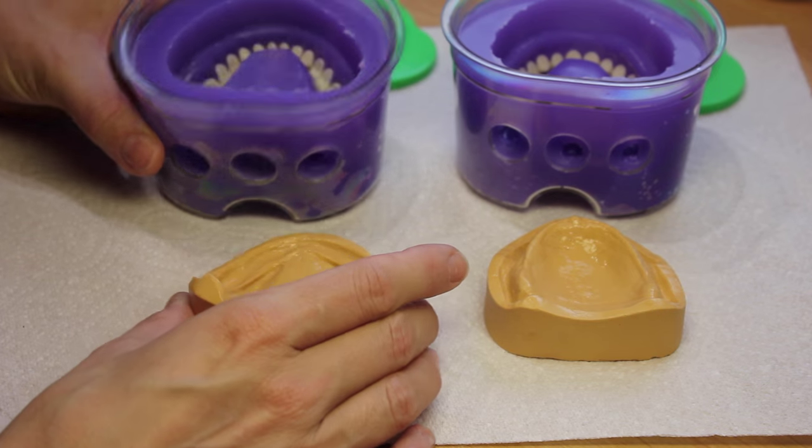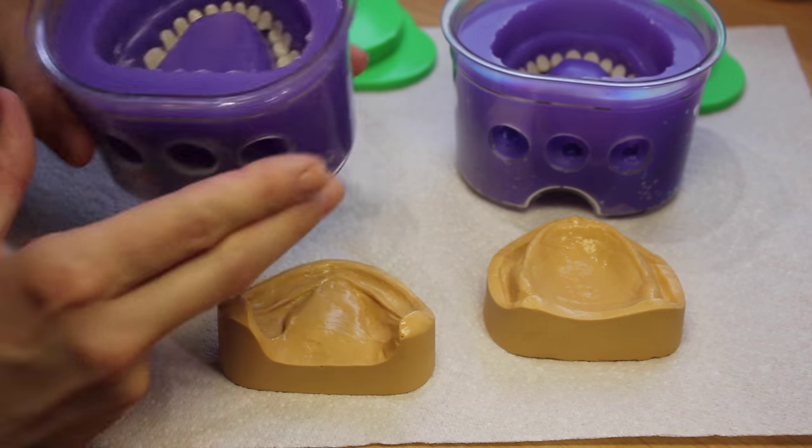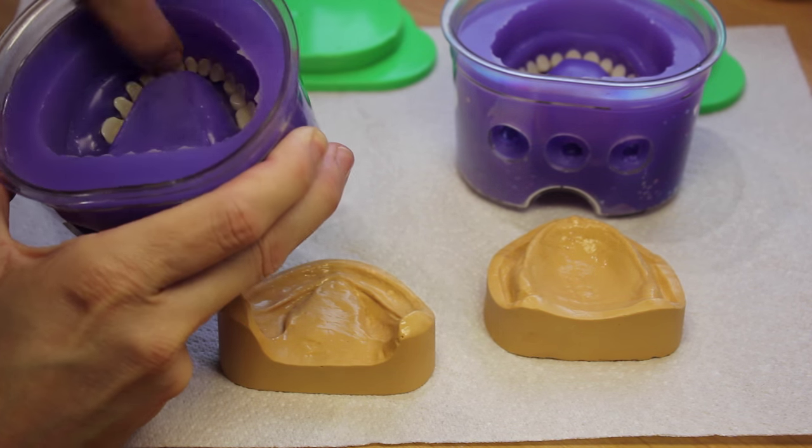Once your separating medium has dried, you can reassemble the flask. It's always a good idea to do a last check that the teeth are all in the right place.